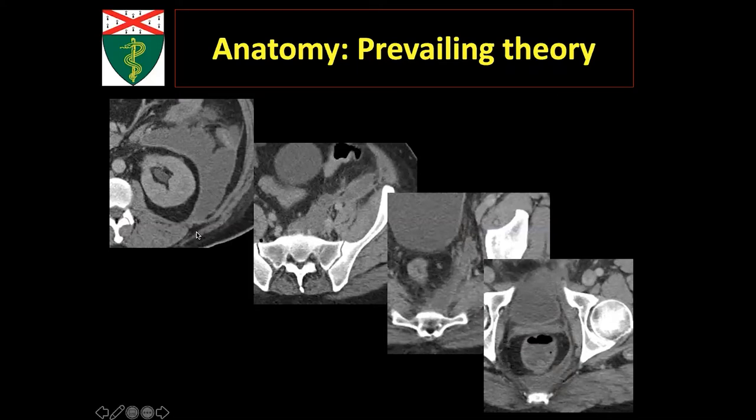So this is a patient with advanced pancreatitis and necrotizing collections. You can see that the inflammatory process and the collections are expanding the retromesenteric plane over here, the retrorenal plane, expanding the fascial trifurcation. All this is going downwards, expanding a combined interfascial plane on the left side. On the right side, we hardly see that plane because it's normal.